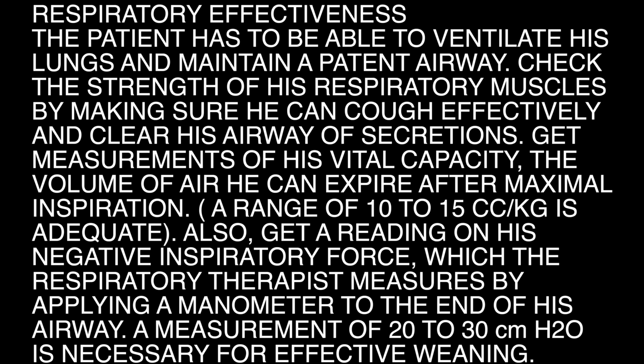Check the strength of his respiratory muscles by making sure he can cough effectively and clear his airway of secretions. Get measurements of his vital capacity, the volume of air he can expire after maximal inspiration. A range of 10 to 15 cc per kilogram is adequate. Also, get a reading on his negative inspiratory force, which the respiratory therapist measures by applying a manometer to the end of his airway. A measurement of 20 to 30 centimeters of water is necessary for effective weaning.